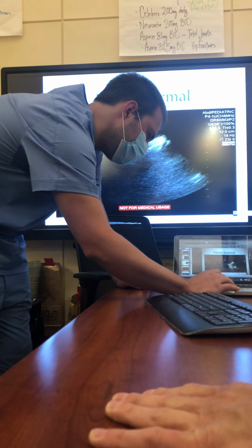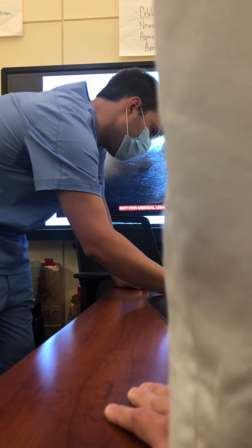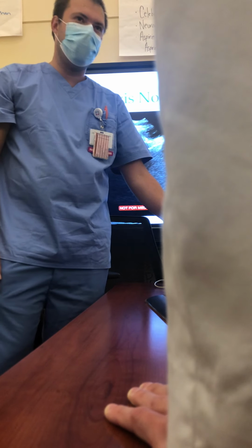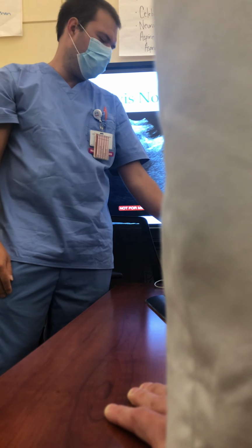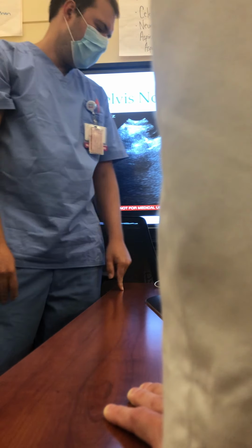There is a couple of things in here though that I do want to point out. See when they come in. Boom. So do you see how there's something here? It looks like there's a stripe of fluid. This is also a false positive. Something to keep in mind.